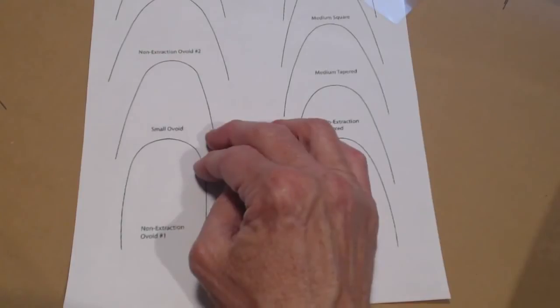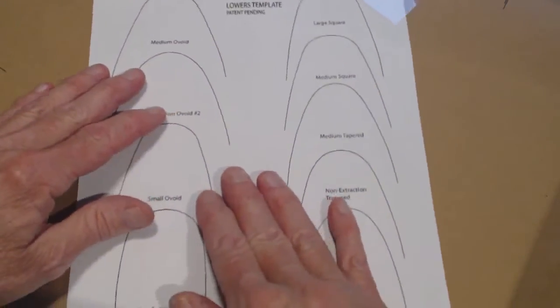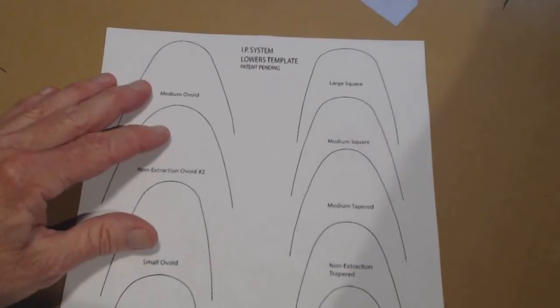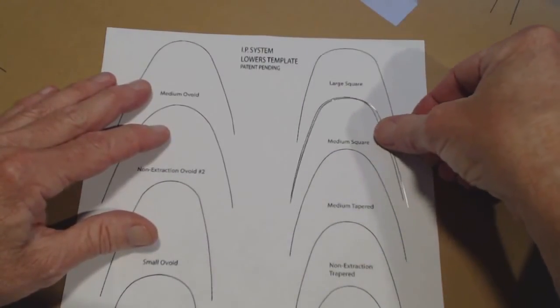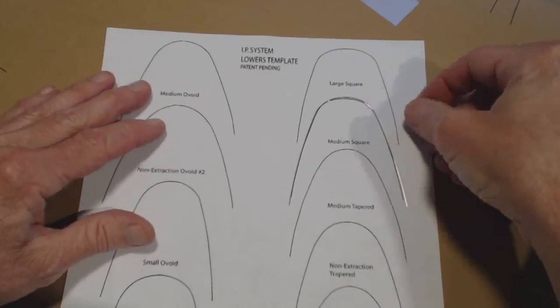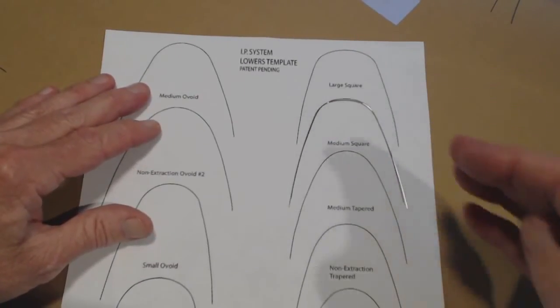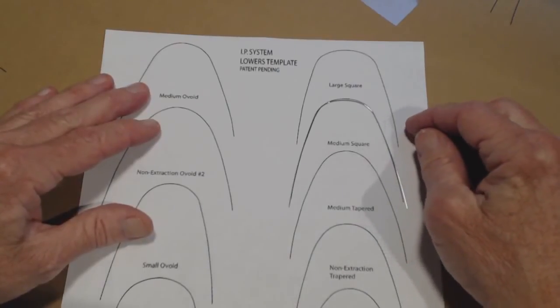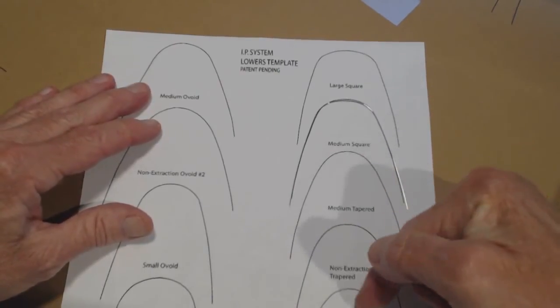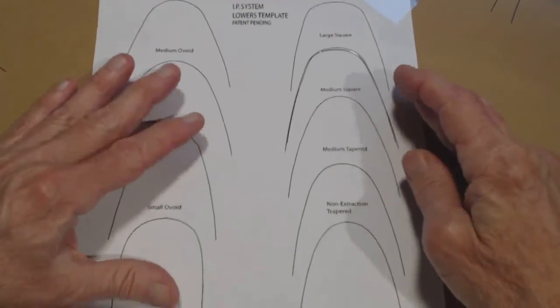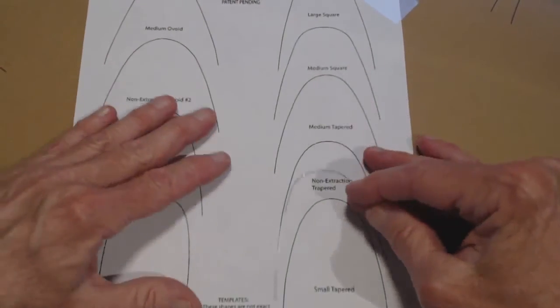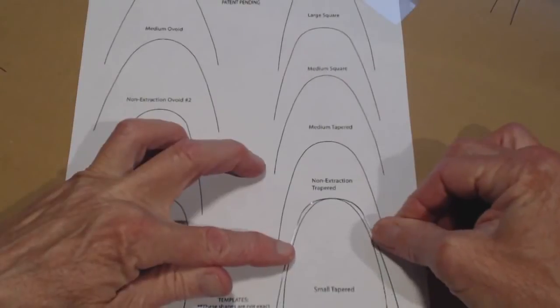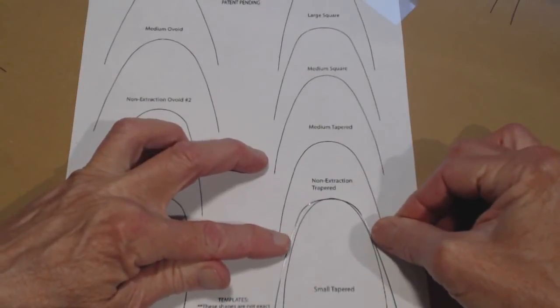So the next exercise, we're going to look at a medium square lower. And we're going to take one out of the package. And here's a medium square. And you see the medium square fits the template fairly accurately. It looks pretty nice. And then what we're going to do now is make this into a small taper. Let's go look and see what the difference is. And you can see what changes have to be made.